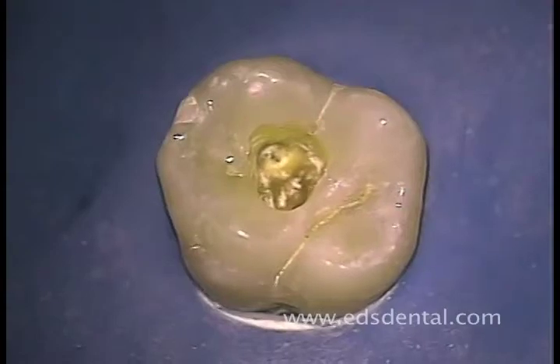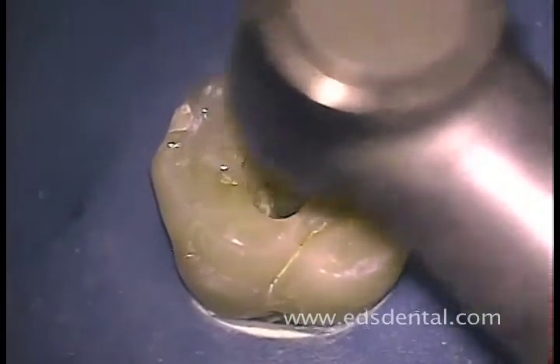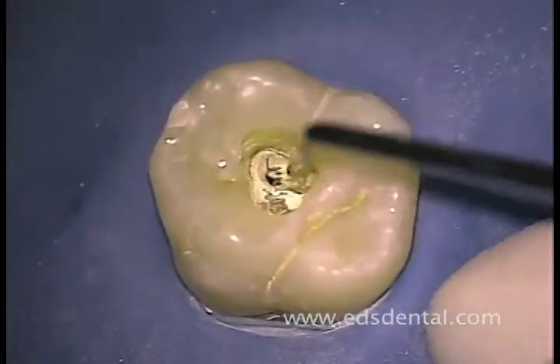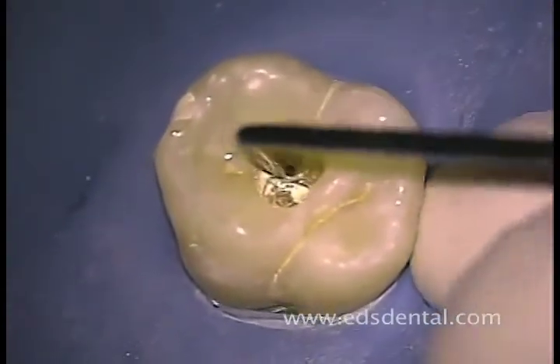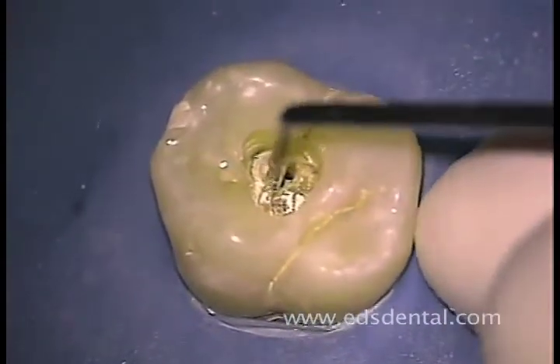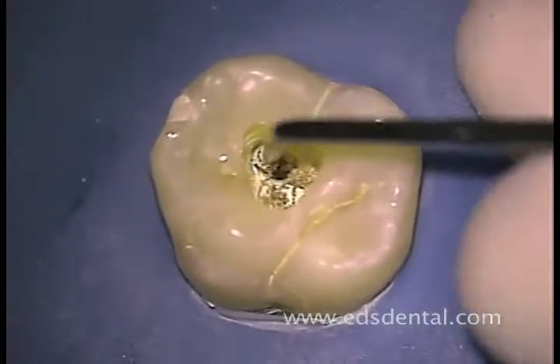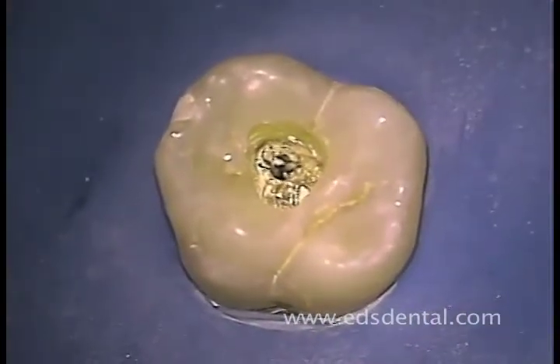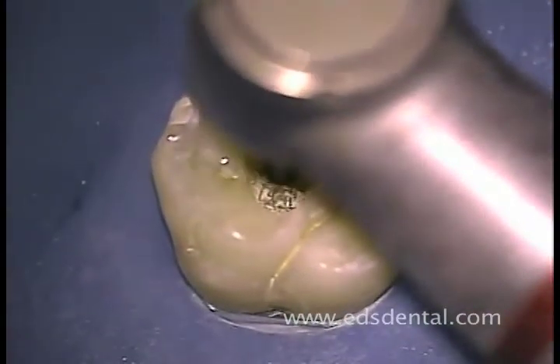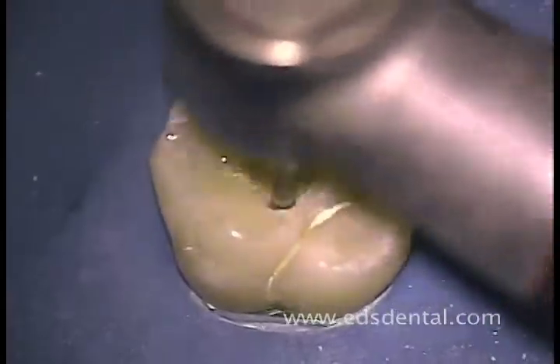At approximately 5 to 6 mm of depth, I notice what appears to be the first opening through the roof of the chamber in the mesial buccal aspect of the access opening, as well as an opening on the distal palatal portion of the roof. I proceed to remove more of the overlying roof and the mesial buccal opening becomes quite pronounced. Please be aware that this is not the mesial buccal canal.